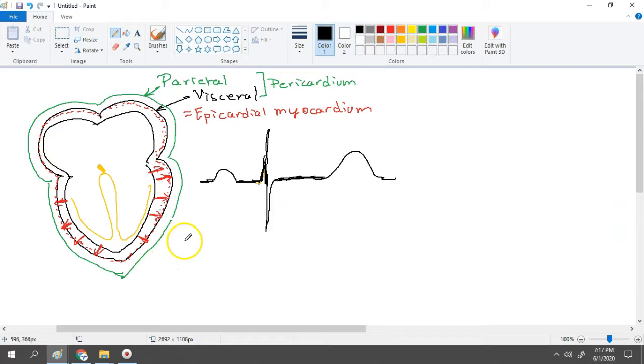In other words, diffusely there is a flow of current from the endocardial region to the epicardial region. So that gives us a diffuse injury current going from the endocardial to the epicardial surface, and at what point? After the QRS, that is, it flows during the ST segment.